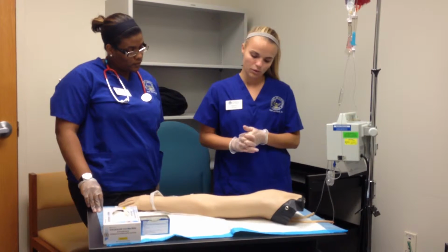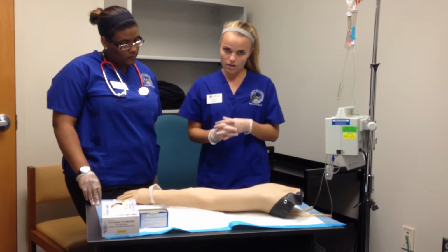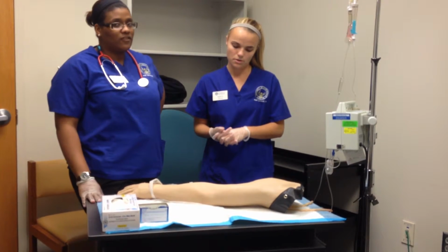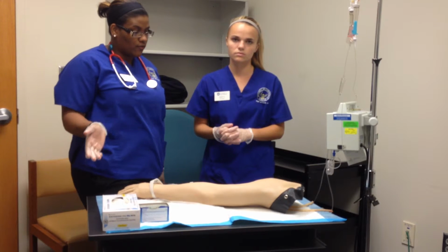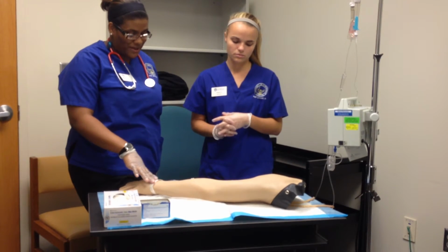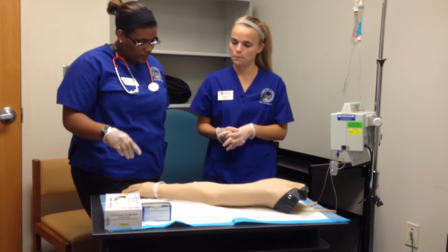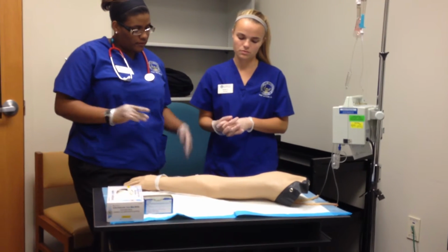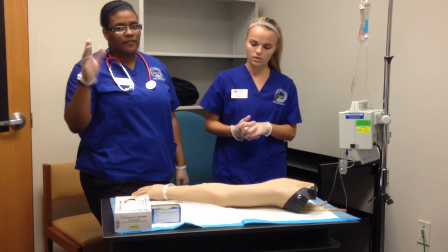You want to collect the required blood and urine specimens at intervals following your facility's protocol after the blood transfusion to make sure that everything worked out right, and document the infusion reaction on the patient's chart. The information we document in the chart would be the time of the transfusion, the people who started and ended the transfusion, the names of the individuals verifying your ID bracelet, any unique product identification number on the blood bag, the product volume that's being infused, and the immediate response, like there's no apparent reaction or there is a reaction, and how you're tolerating the transfusion.